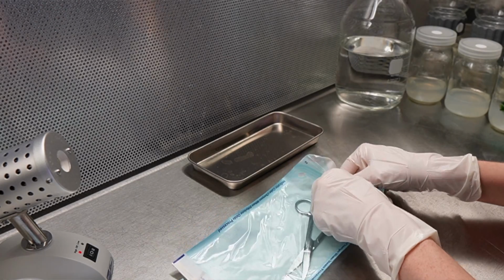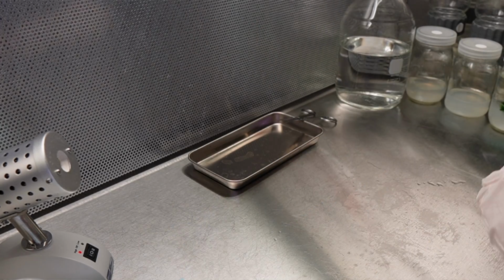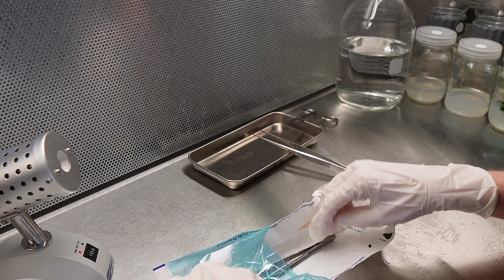If you're curious, the media inside of the BioCouplers contains half-strength MS and 30 grams per liter of sucrose, which is sugar.